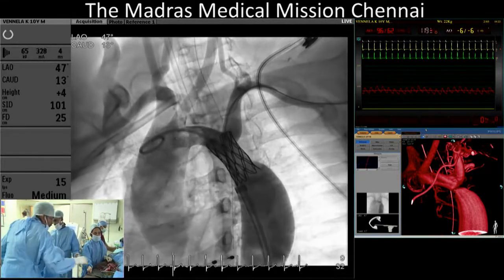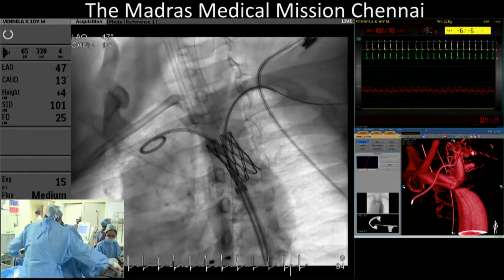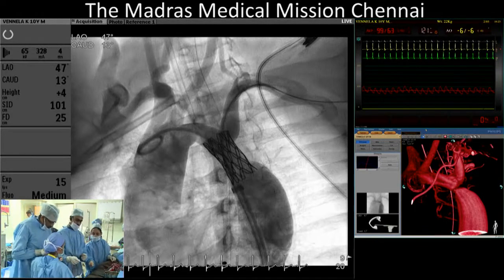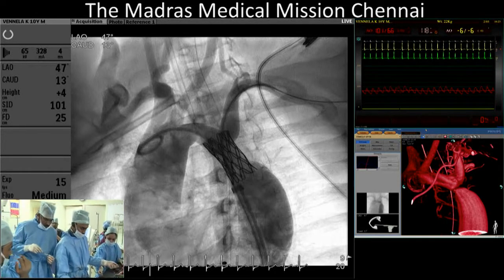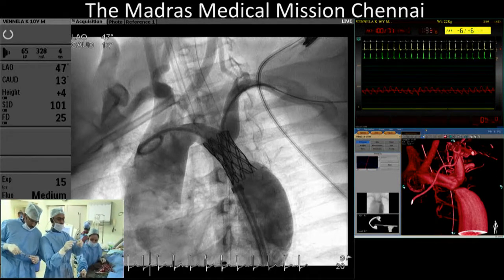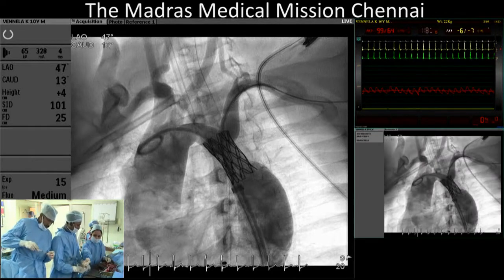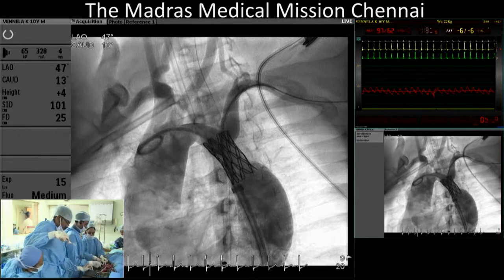Yeah, these arches don't grow. They don't grow. That's an illusion. In the long term, the surgeons don't do a better job in adults with coarctation either. It's not a risk-free procedure. The majority of congenital surgeons shy away from transverse arch hypoplasia coarctations. They do not want them because the risks of paraplegia, ischemia, cord, all of those are not minute. They're actually significant. I fully agree.